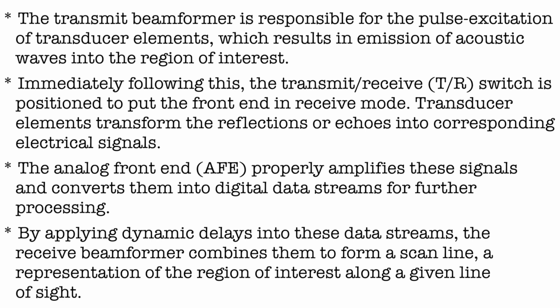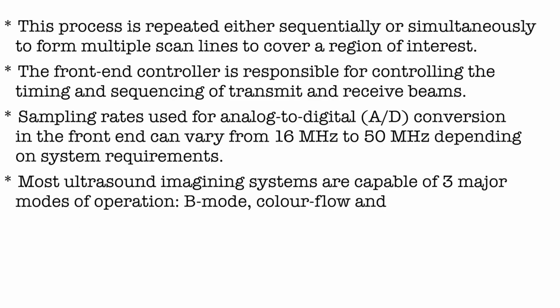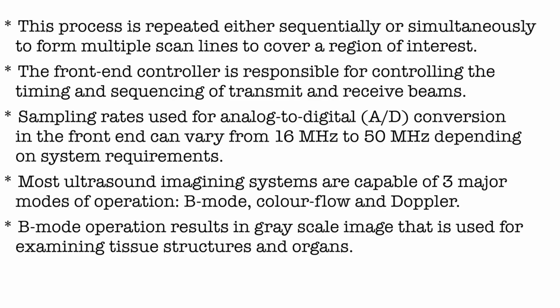By applying dynamic delays into these data streams, the receive beamformer combines them to form a scan line, a representation of the region of interest along a given line of sight. This process is repeated either sequentially or simultaneously to form multiple scan lines to cover a region of interest.